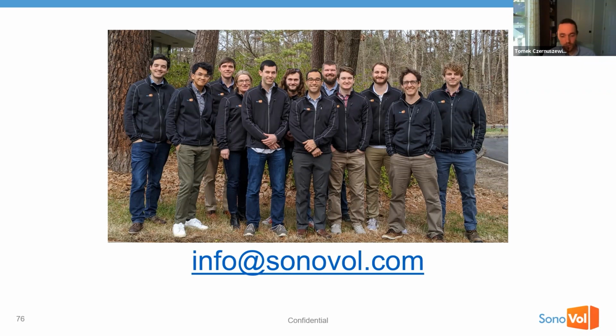And then if you want to add on the perfusion imaging as well, that adds probably another 5 minutes. You have to do an injection. So the full workup is probably on the order of 5 to 10 minutes per animal if you want all three parameters. But we're constantly working on ways to speed that up. Part of this new software release, where the shear wave mode will be put into true 3D, will hopefully speed up that process as well.